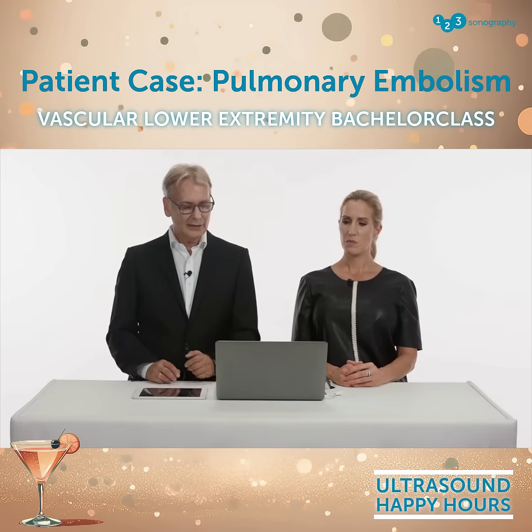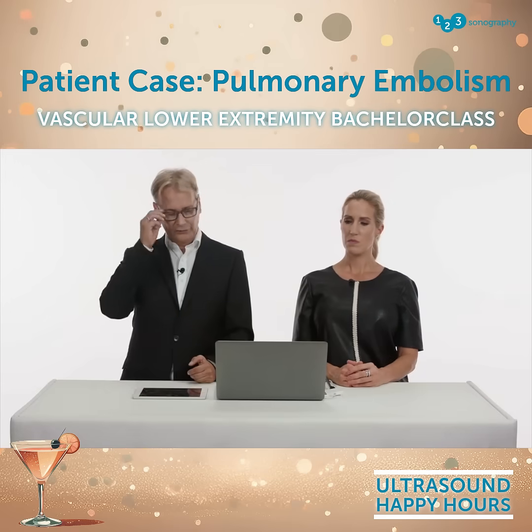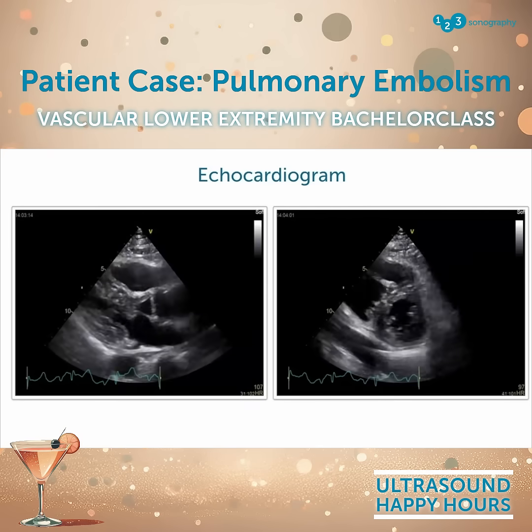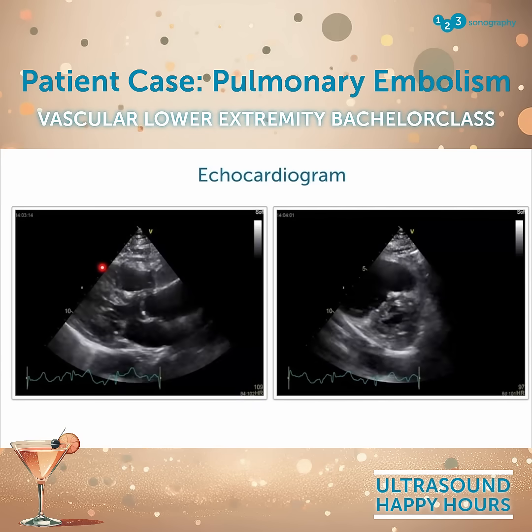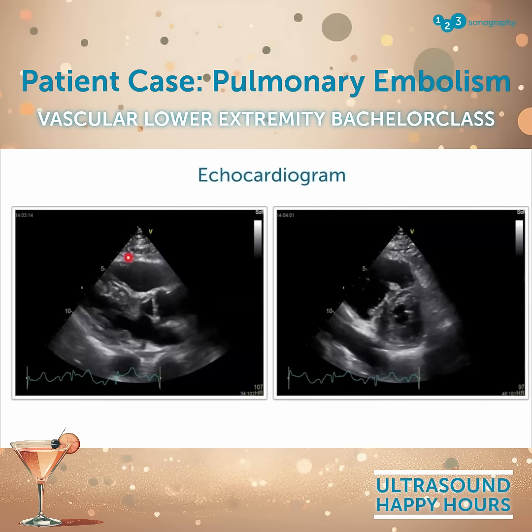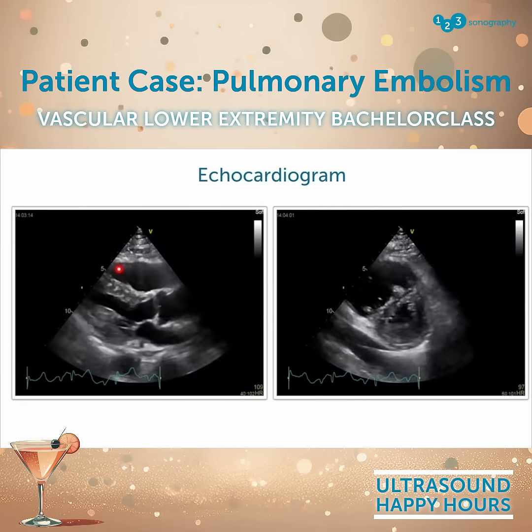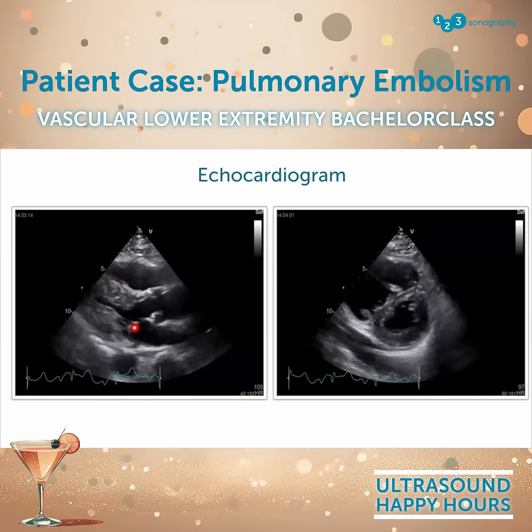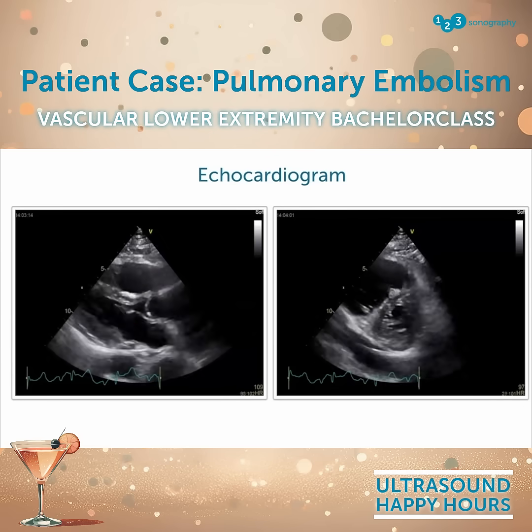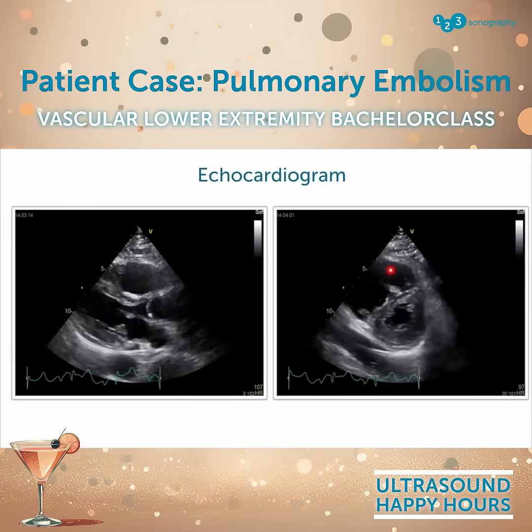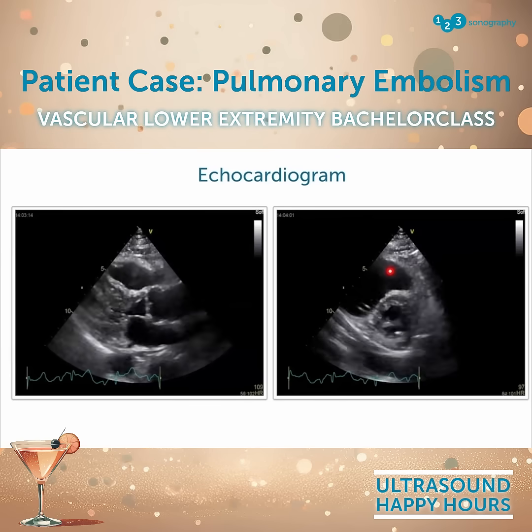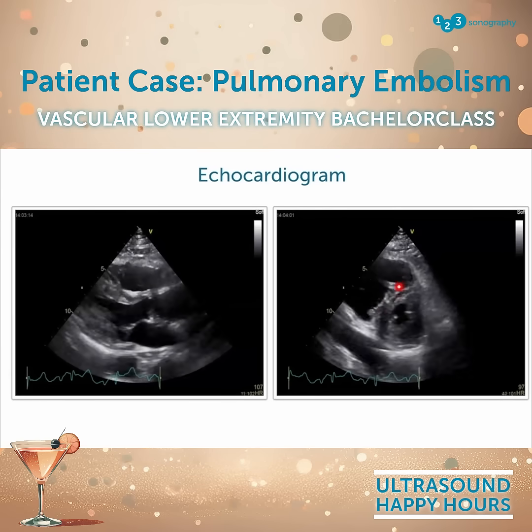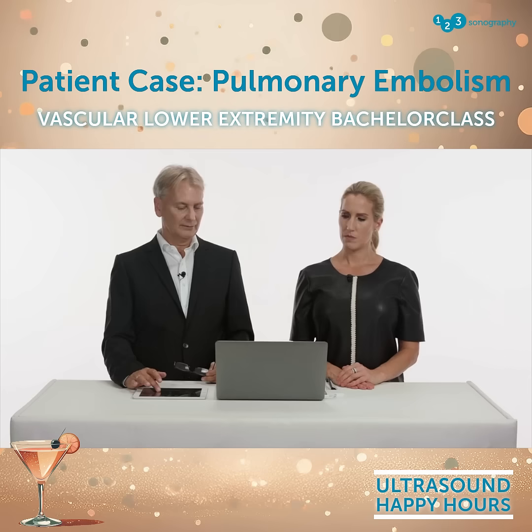Now let's take a look at the echocardiogram. In the parasternal long axis view you will appreciate that the right ventricle is dilated. The valves look normal, and we can confirm that the right ventricle is dilated in the short axis view. In addition, we see flattening of the interventricular septum.